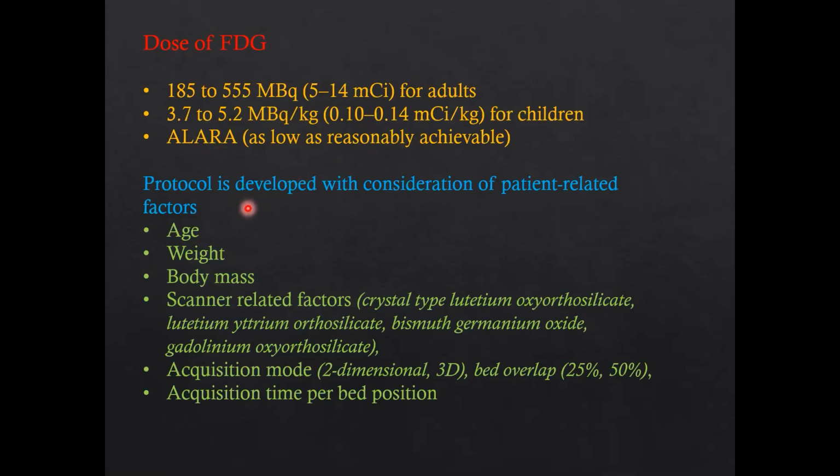And the protocol is developed with consideration of patient related factors like age, weight, body mass. Scanner related factors are there technically, depending on the crystals which are used in the PET, that are known as scintillators. Then acquisition mode, whether it is 2D, 3D or bed overlap. Then acquisition time per bed position. This is very important.